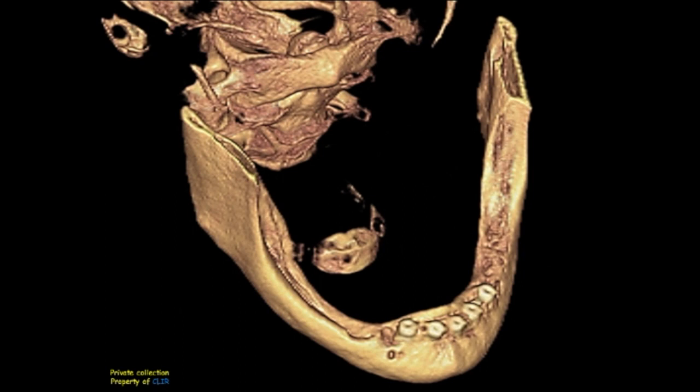On this slide, we can see a CBCT construction showing the crestal position of the mental foramen, the anterior buccal ramification of the mental nerve, and the empty osteotomy. On this next slide, a cross-sectional cut also shows the empty osteotomy and the buccal ramification.